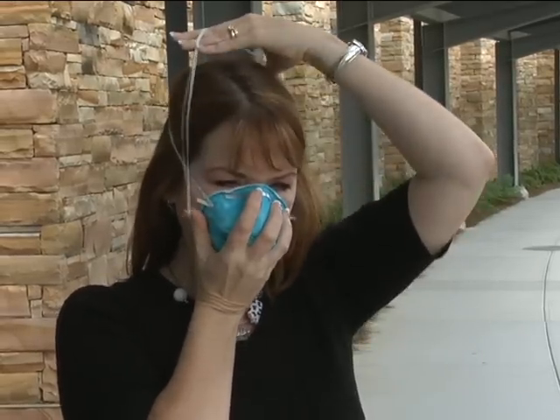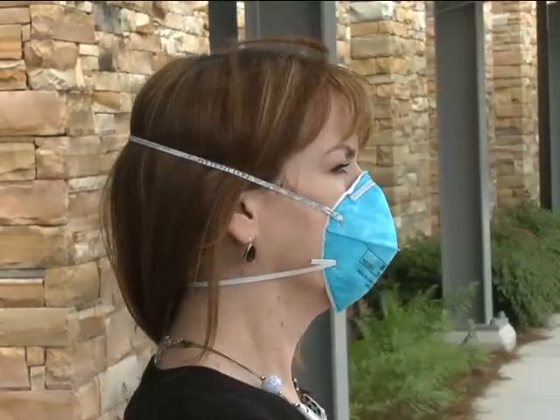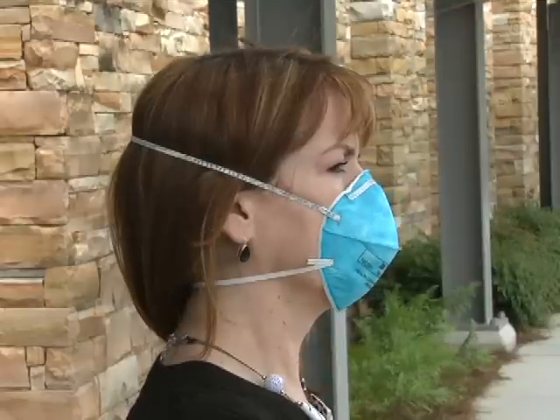Pull the bottom strap over your head and position it around the neck and below the ears. Be sure not to crisscross the straps. If there is only one headband, it should rest high at the back of your head.